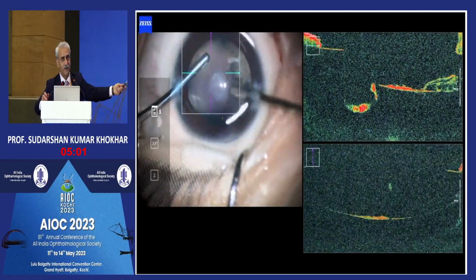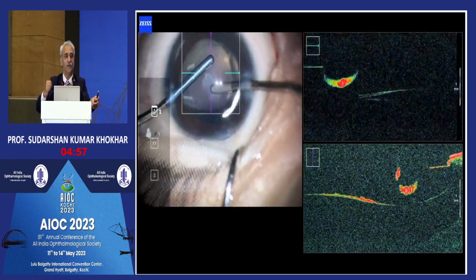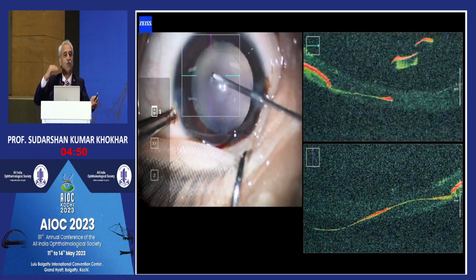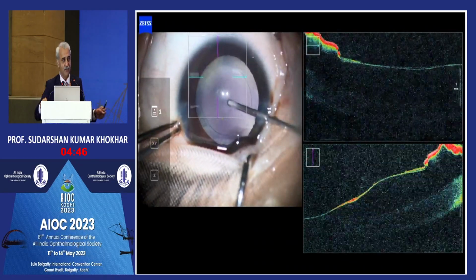So no big deal, you can see it otherwise also. So what happens when you break this membrane and try to see what's behind? You expect a hyaloid layer, but in this patient, it has multiple layers. It had 2-3 layers, and one was the hyaloid layer, and one more layer was in between. We don't know what the layer is there for, but we could pick up just because the OCT was there with us.